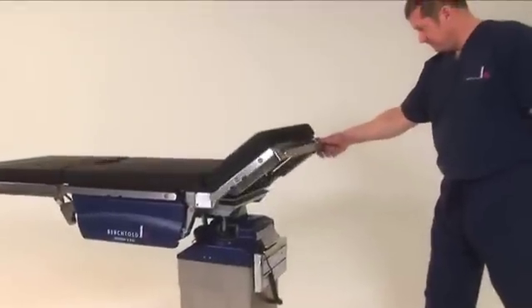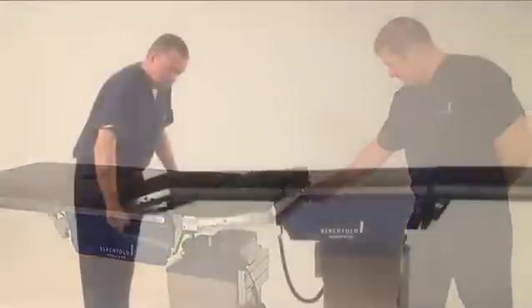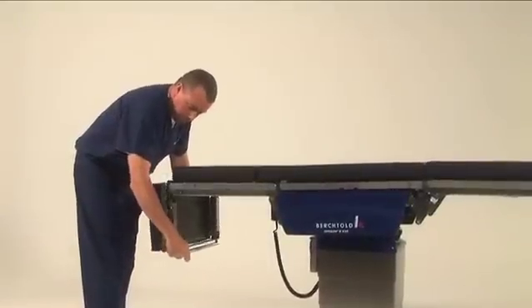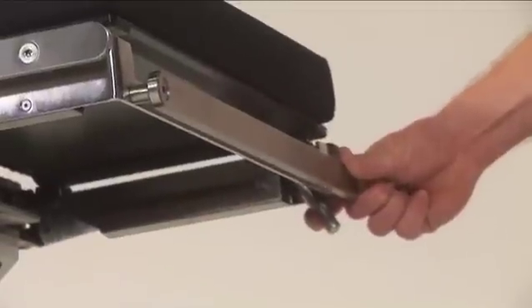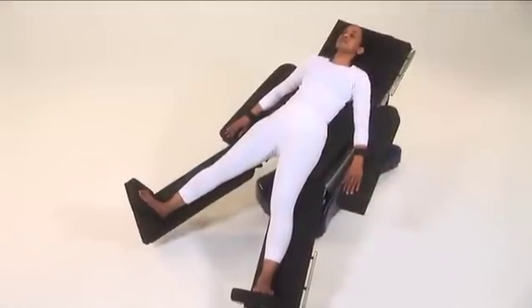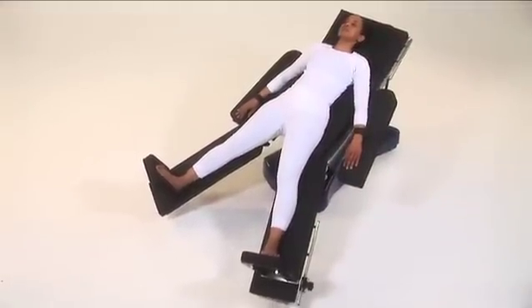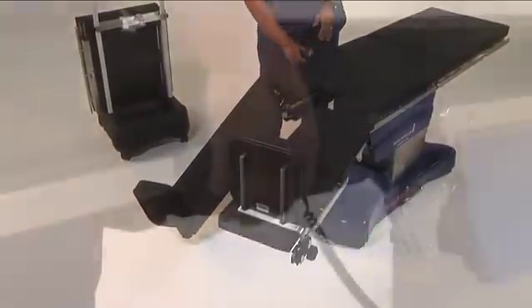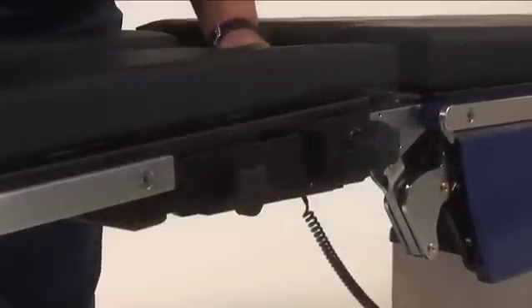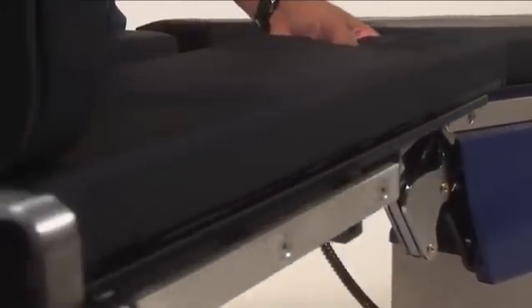The head section can manually be raised by 45 degrees or lowered by 90 degrees using the adjustment lever on the right-hand side. The Operon D850 features power split leg functionality to raise and lower the leg sections, but for patient safety, the abduction and adduction are handled manually.